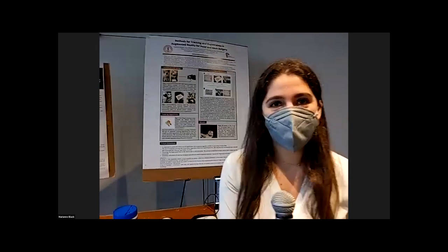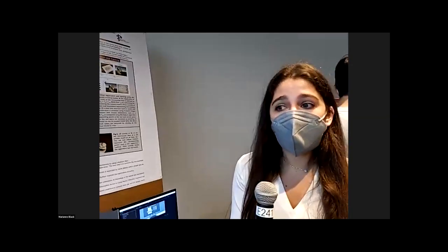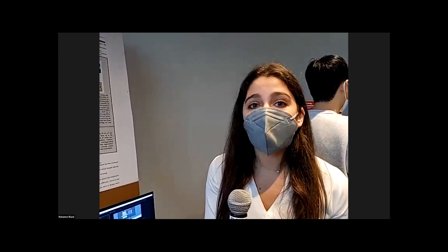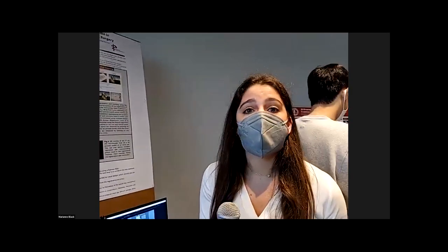Awesome. Can you tell us about your project? Sure. So right now, I'm focusing on methods for tracking and registration in augmented reality for head and neck surgery. In general, these kinds of surgeries are usually done under the microscope and very space-limited. We use tracking hardware such as electromagnetic tracking in order to know where everything is in the surgical field, such as the patient's head, the microscope, and the surgical tools. However, we always have issues with these kinds of trackers because of electromagnetic interference.